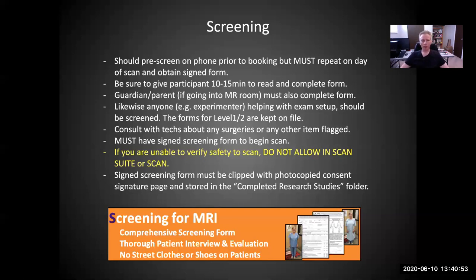Now, we should also remember that in the case of a children's hospital, it's often the case that a guardian or a parent will be going into the MR room with the child. And this is different from a lot of other MR centers where only the participant will go into the room. This means that they have to be screened as well. And the screening may be slightly different, but we still ask them to complete the same form and to ensure that they're safe to go in there as well.